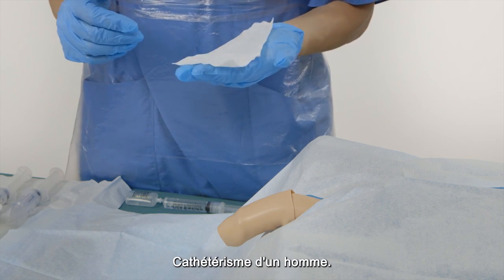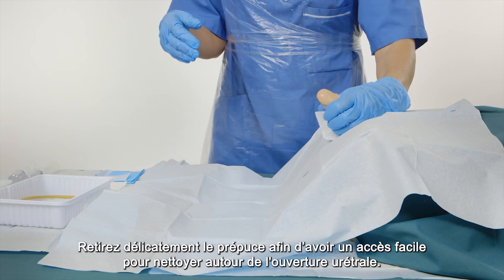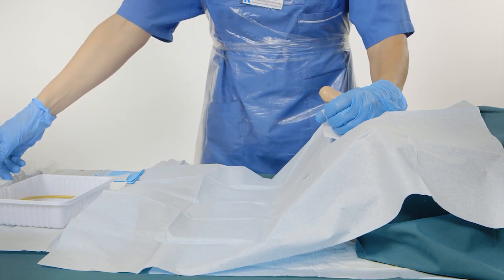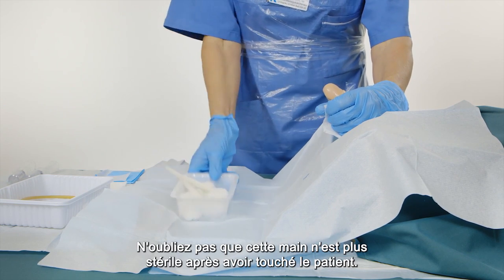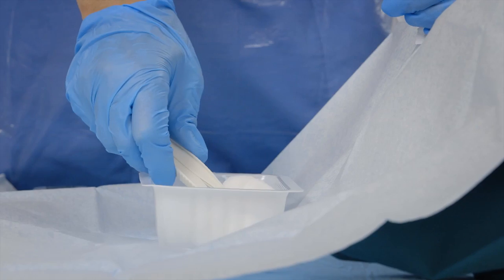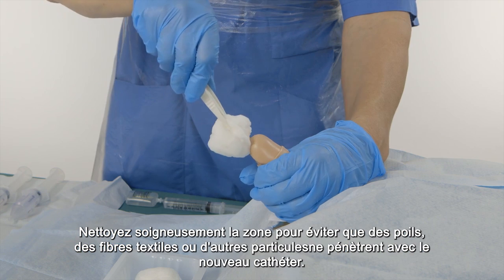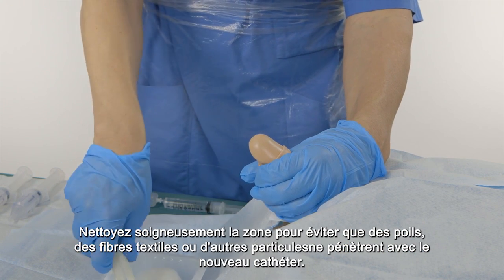For catheterization of a man, gently pull back the foreskin so you can easily access and clean around the urethral opening. Remember that this hand is not sterile anymore after touching the patient. Carefully clean the area to avoid any hairs, textile fibers, or other particles entering with the new catheter.